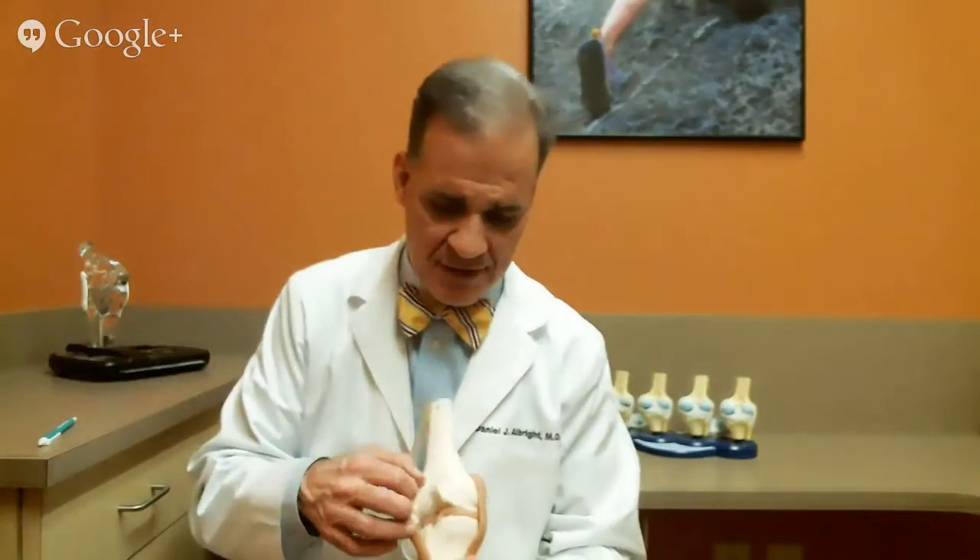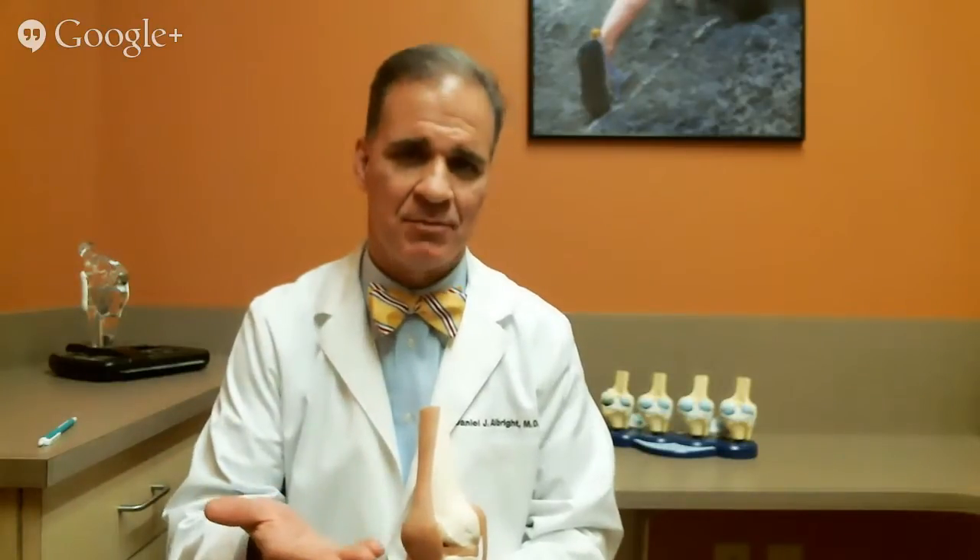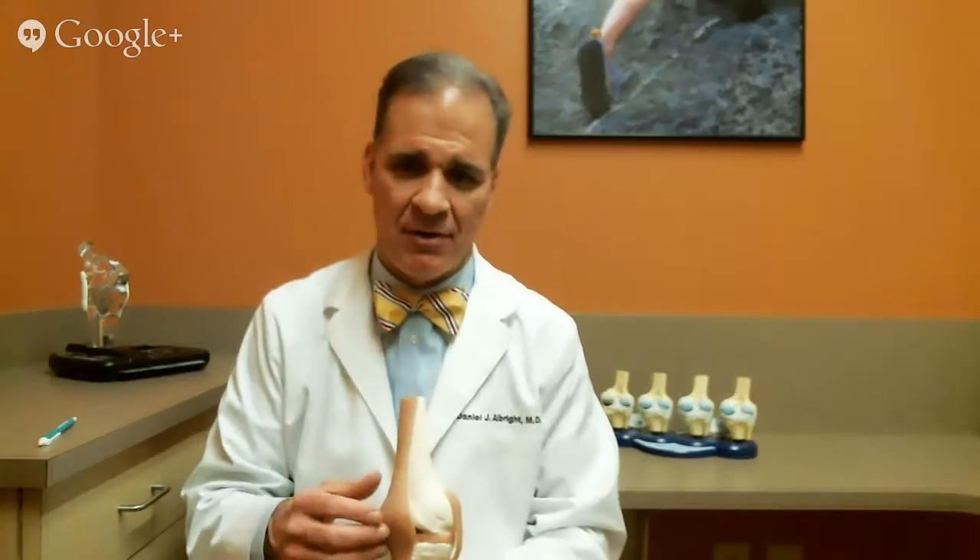The next thing you do is you take a quarter inch off the tibia. The knee is a hinge joint and it's pretty easy to expose. A quarter inch comes off the end of the tibia and you cement in another metal piece — it's a base plate with a little stem that goes down the bone. That's pretty straightforward.